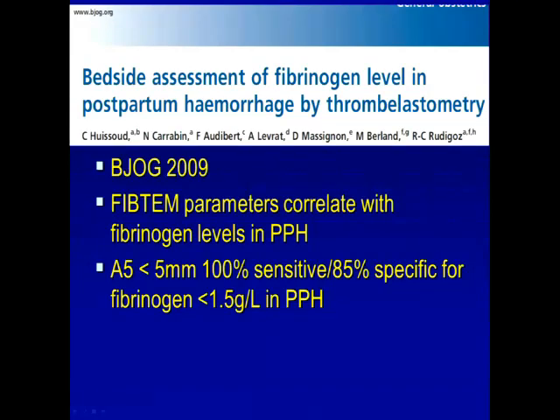Right, but oftentimes what happens, like in our ORs right now, is the nurses are using that screen to put in orders and stuff like that. Where you're doing the charting, on the anesthetic machine computer? Yes, we've got computers on every anesthetic machine now. You'll have to flip back and forth potentially, but certainly you've got the machine itself. But I'm just thinking down in the trauma bay and in ICU.